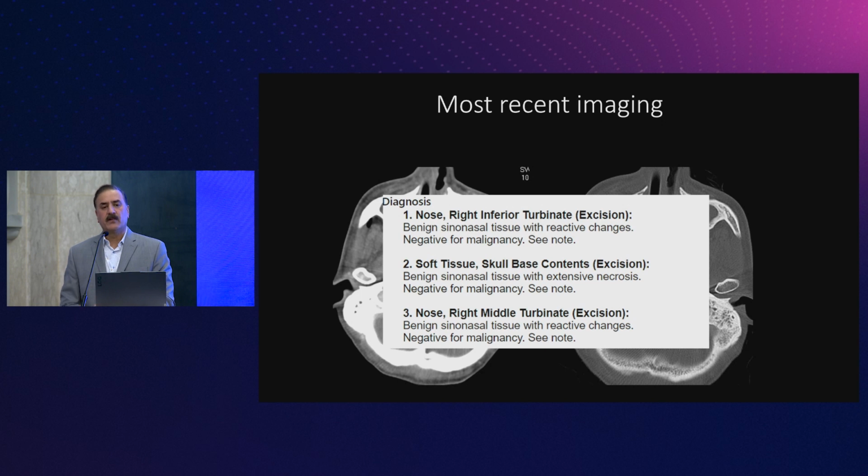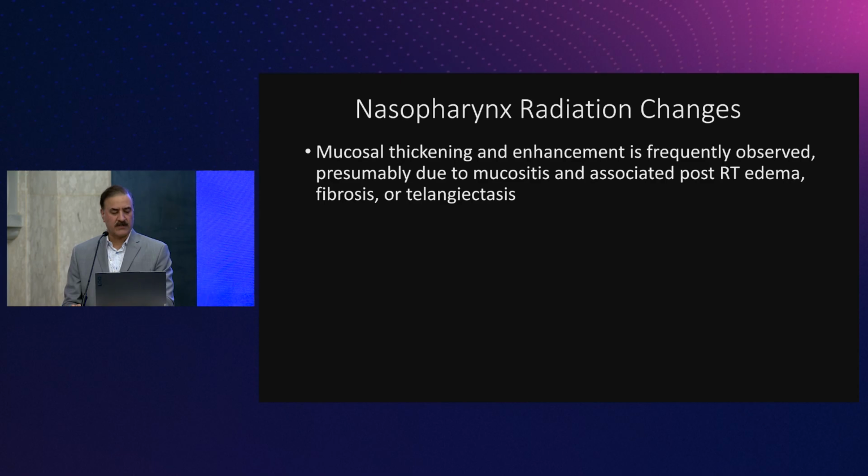But again, you can see multiple biopsies were taken, and all of the biopsies came out negative for cancer in this patient also. So this gives you an idea about how bad some of these radiation changes can be, especially in the central skull base region.